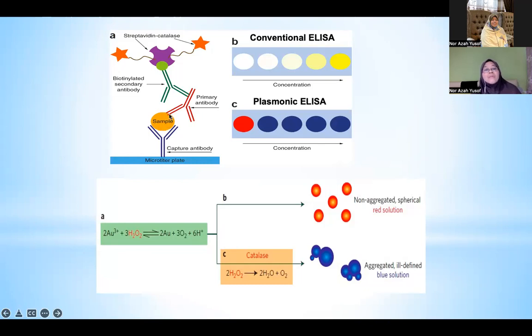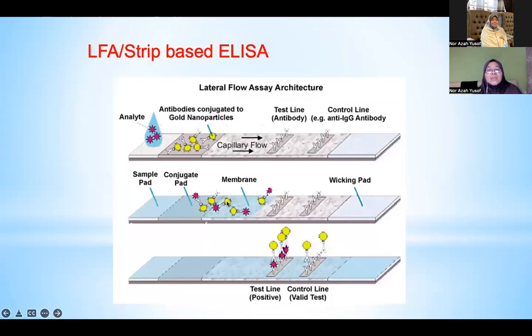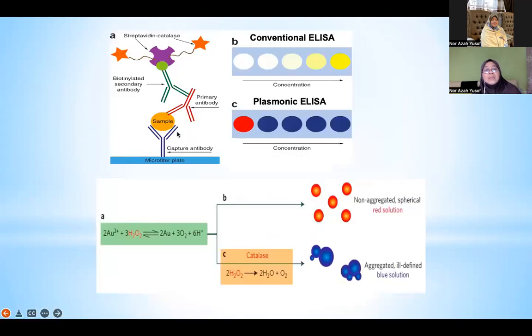And then, in order for us to have the color, you can see that the yellow color is actually gold nanoparticle. The one that you use for your test strip is actually gold nanoparticle. That gives us the naked eye detection that enables us to see the color production. If not, then of course we cannot see. Let's say if we use another, you can use enzyme as the tagging.